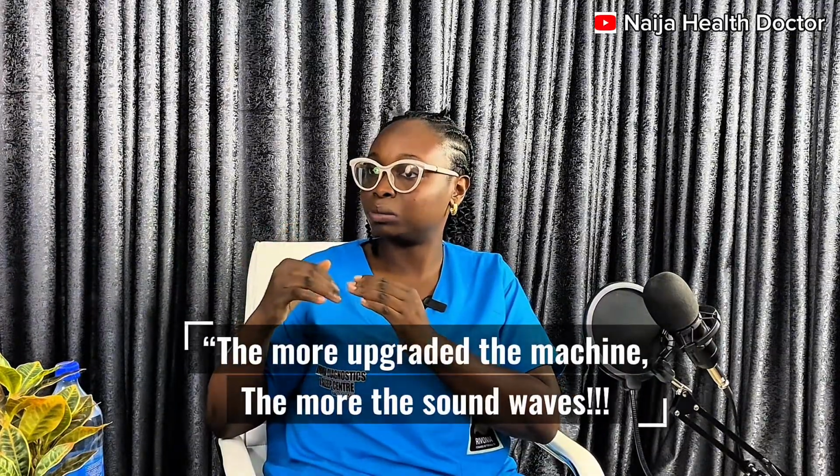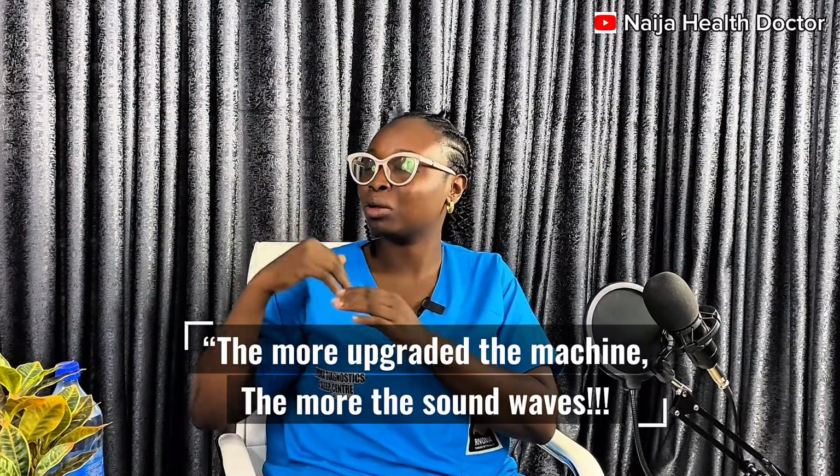There are different types of transducer, like I said earlier, and they each use different frequencies. So for a pelvic scan, we use a convex probe. The more dimensions, the more upgraded the machine is, the more sound waves it sends to the child. So it can affect the child, though it has not been clinically proven.